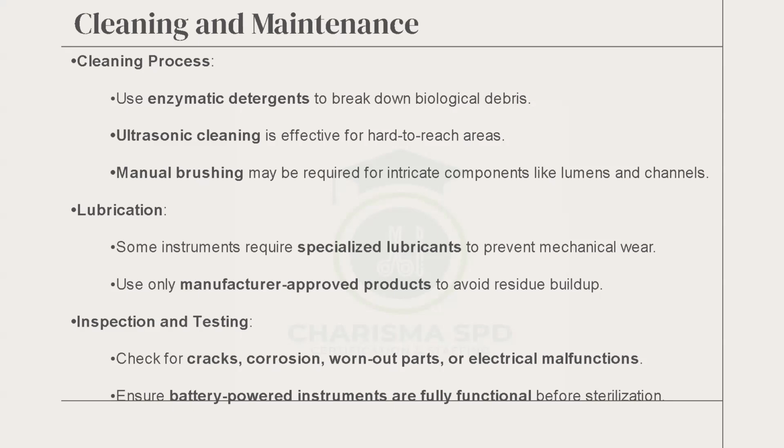But I want to caution everybody here that when it comes to powered surgical instruments, please be mindful. Do not immerse in water. Do not soak it. We know from the onset that if you are working in decontamination, you have to soak your instrument. But when it comes to powered surgical instruments, you don't soak them.